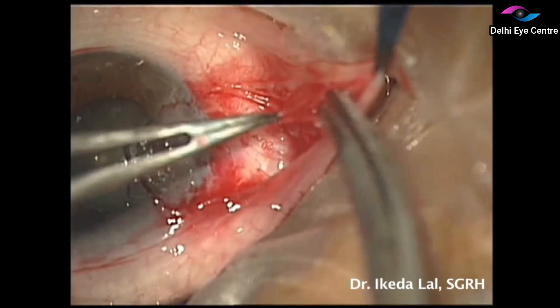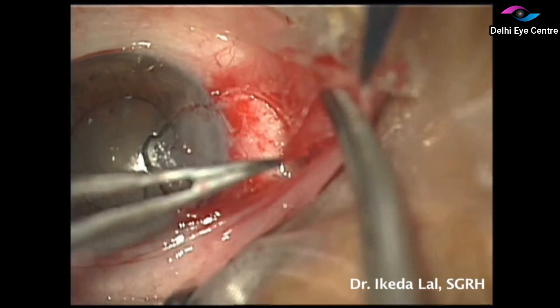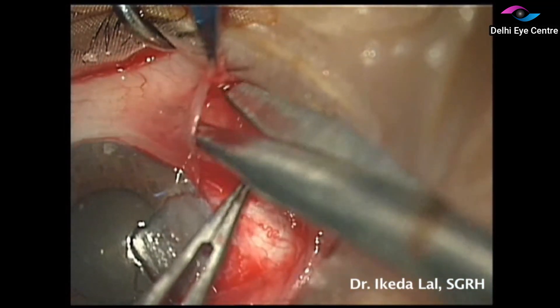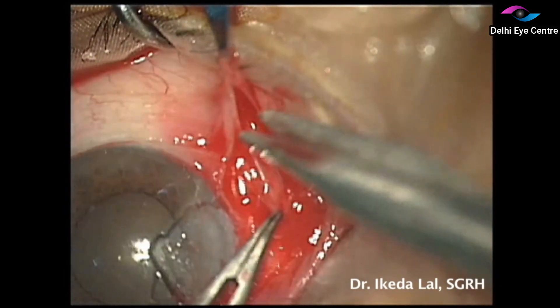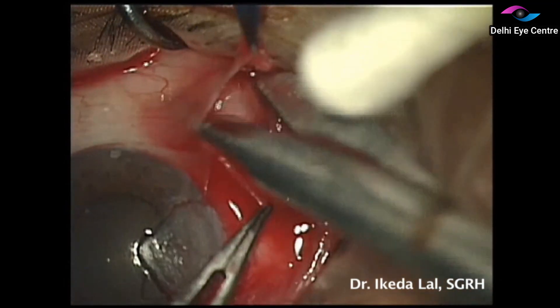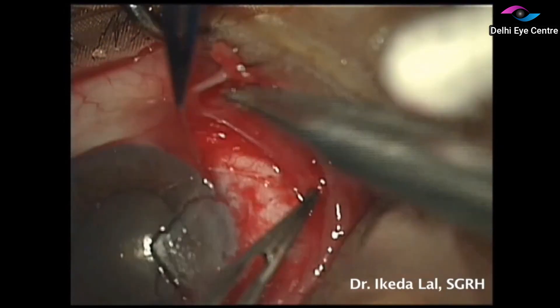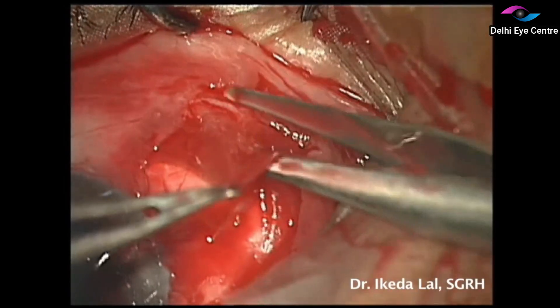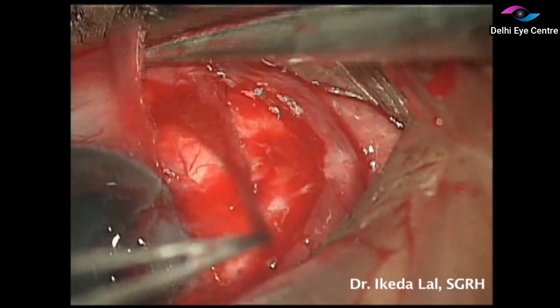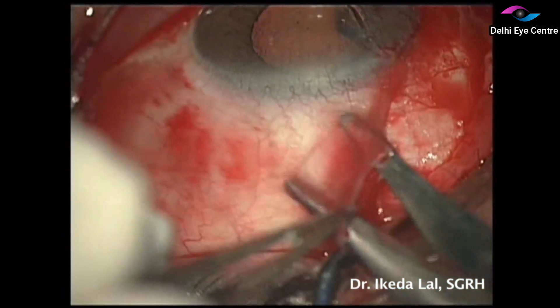Pterygium is a degeneration of the conjunctiva, therefore it is important for us to dissect all this degenerated subconjunctival tissue to avoid recurrence. Here we are using a combination of sharp and blunt dissection technique to free up the underlying subconjunctival tissue and subsequently excise it. Then we measure the defect that we have created and accordingly take a conjunctival autograft.